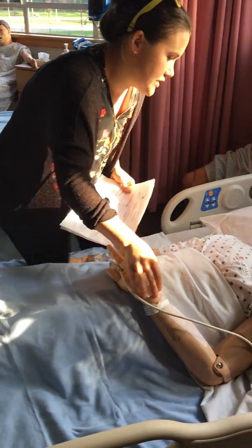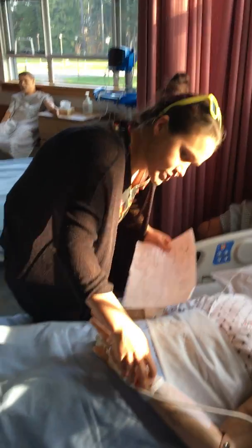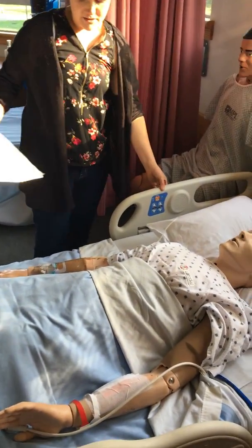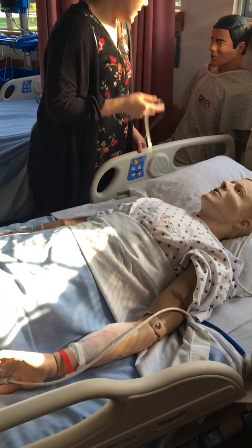I'm going to ask her if she has any allergies. She can't tell me because she's passed out. That's why I'm giving her the drug. So I check her allergy band. She's allergic to tetracycline, and I'm not giving her tetracycline. So that's good. Now she has a running IV. Does she have a running IV?